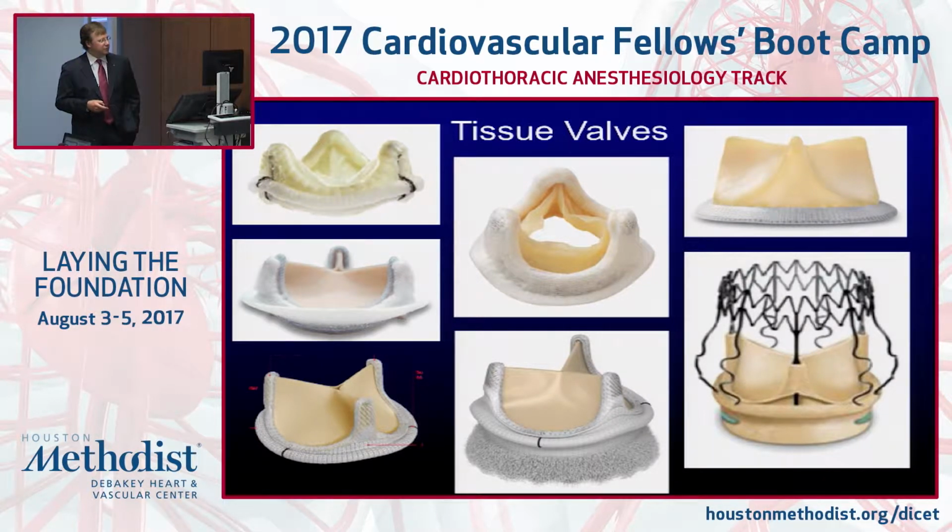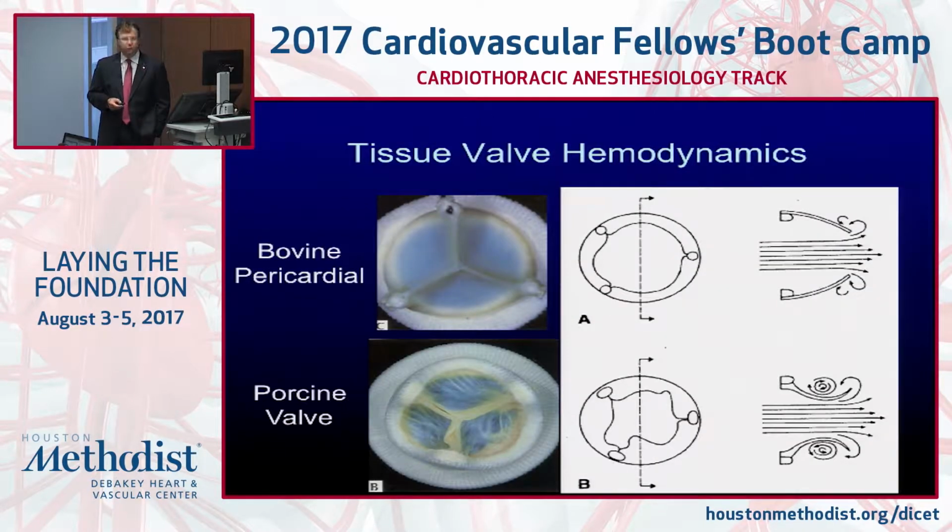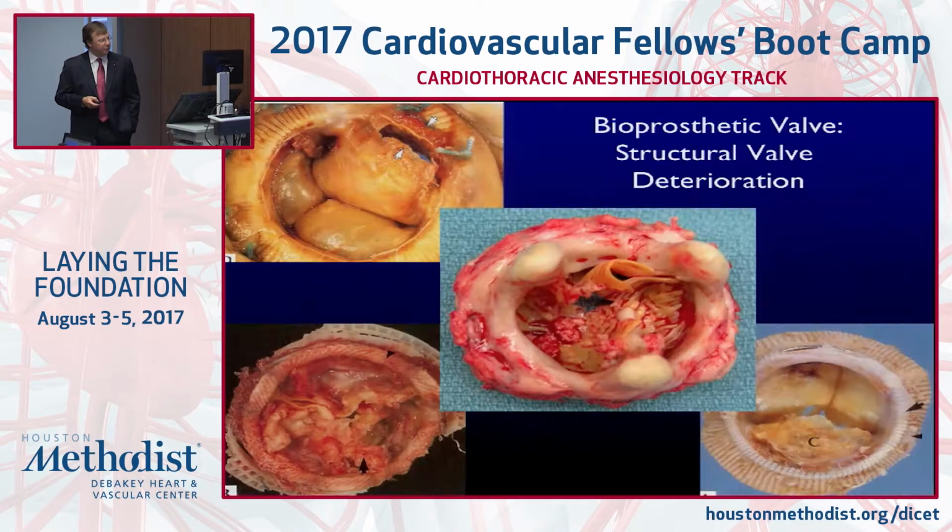And then these are various types of tissue valves. We have all kinds of porcine valves, which are made of a sewing ring and a stent and porcine leaflet tissues. We have pericardial valves, which are made of bovine pericardium in different iterations. We have the externally wrapped valves, which have a larger orifice area, and some of the sutureless or minimal suture valves that also have a larger orifice area. This one was recently FDA approved. The Percival valve was recently FDA approved. And the hemodynamics of the pericardial and the porcine valve, you can see the different vortices and the flow patterns are a little bit different.